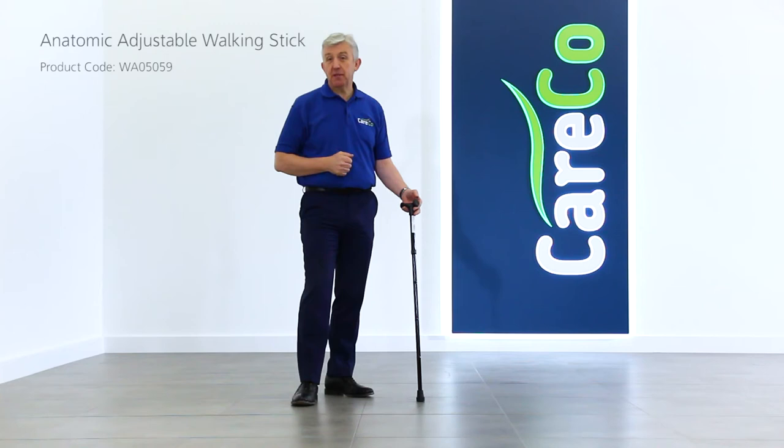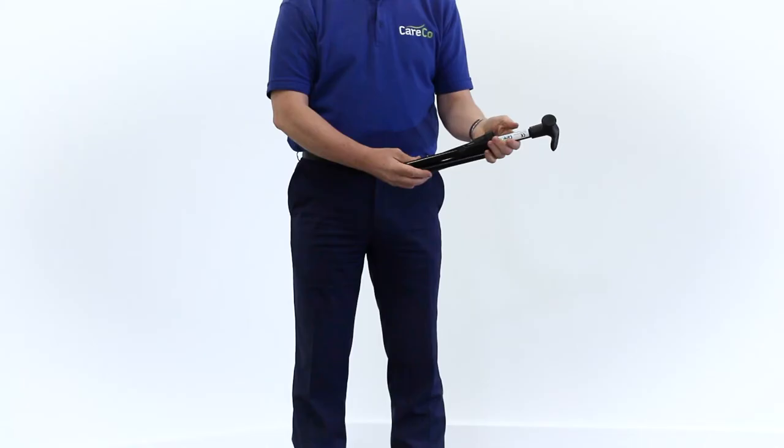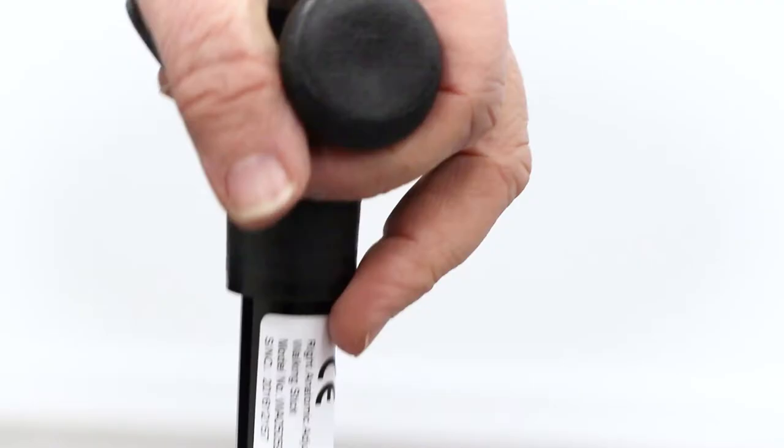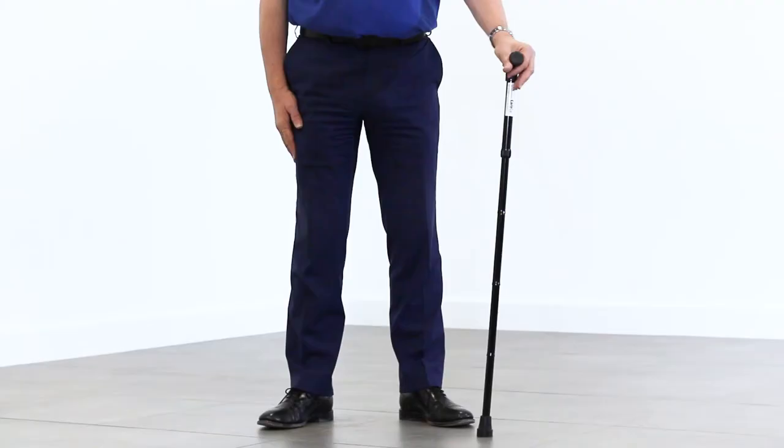This is the anatomical adjustable walking stick, a durable and convenient walking aid for those looking for extra stability in their day-to-day lives. We love this walking stick for its textured orthopedic handle, which spreads the user's weight over their palm and provides excellent support.